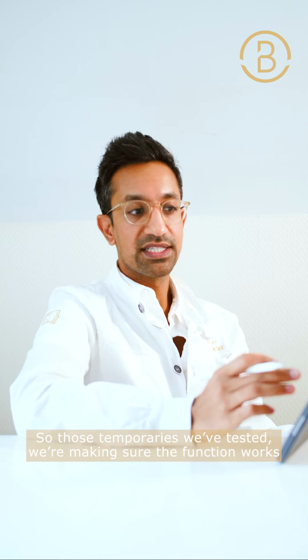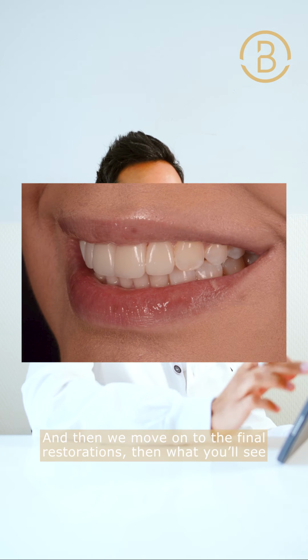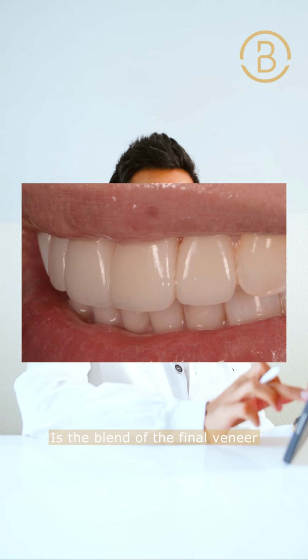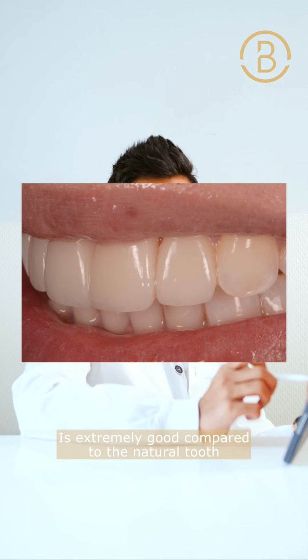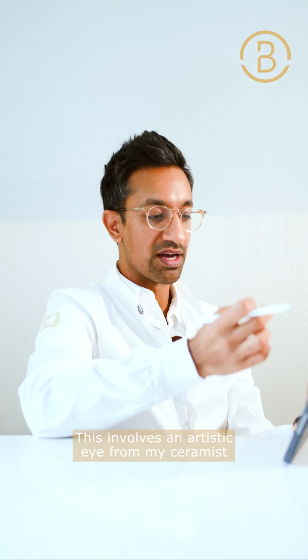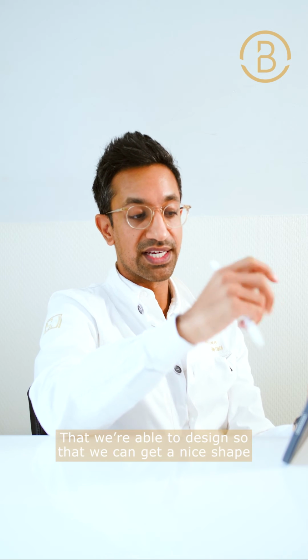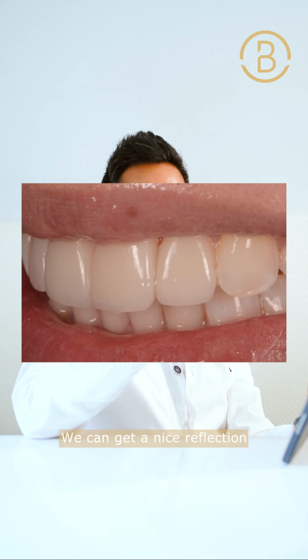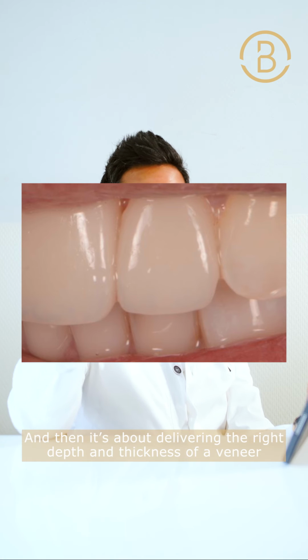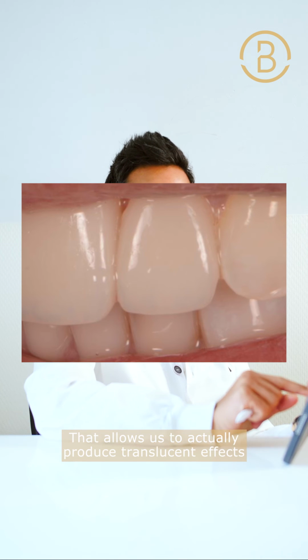So those temporaries we've tested, we're making sure that the function works and the look of it works. And then we move on to the final restorations. And what you'll see is the blend of the final veneer is extremely good compared to the natural tooth. This involves an artistic eye from my ceramist. It involves instructions, and it involves a blueprint of temporaries that we're able to design so that we can get a nice shape, we can get a nice reflection, and then it's about delivering the right depth and thickness of a veneer that allows us to actually produce translucent effects.